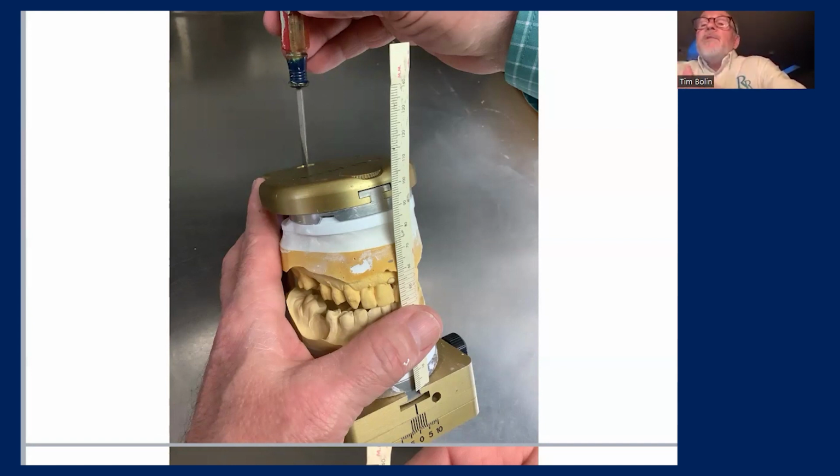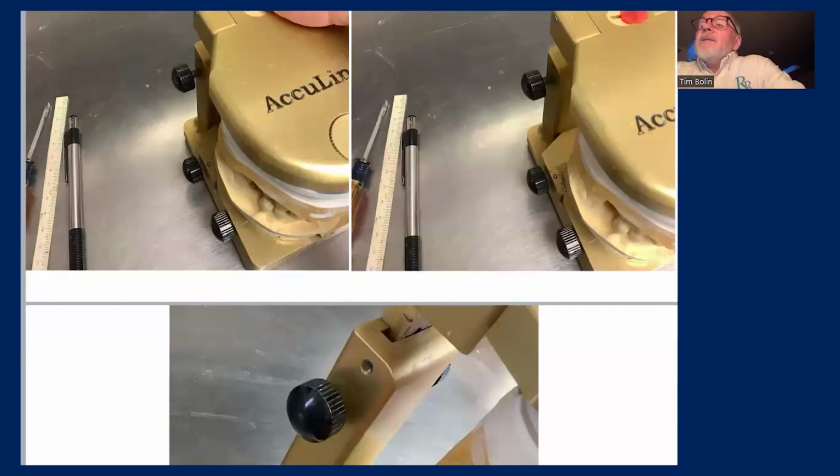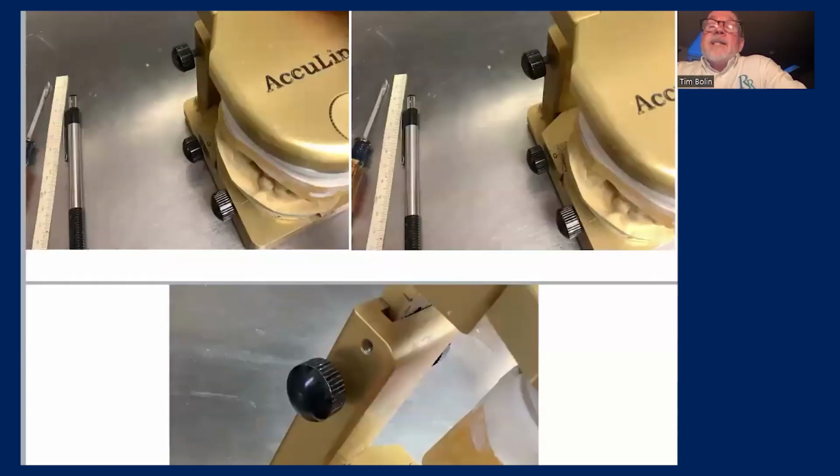Now keep in mind, we reduced it 2.5 millimeters on the vertical scale, and now we're going to get our 5 millimeters with our rotational component. So we're going to open it up another 2.5 millimeters on this ruler. Now we're back to the 5 millimeters that we initially were looking for. So now we're going to advance the mandibular plate. We're going to move that AP position 2.5 millimeters forward. That's going to simulate translation as well as rotation. So the mandible's coming forward 2.5 millimeters and going up in the anterior 5 millimeters.